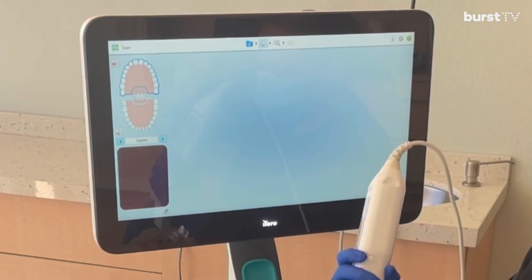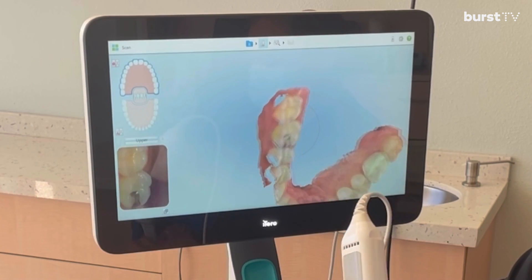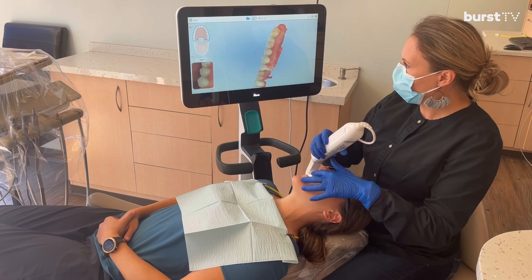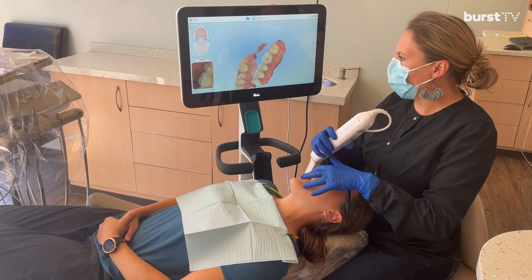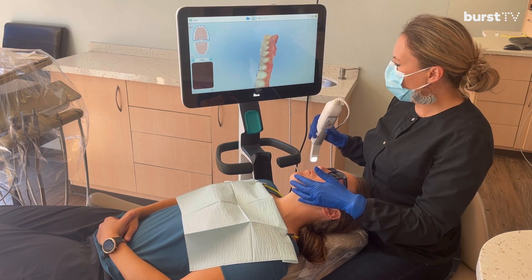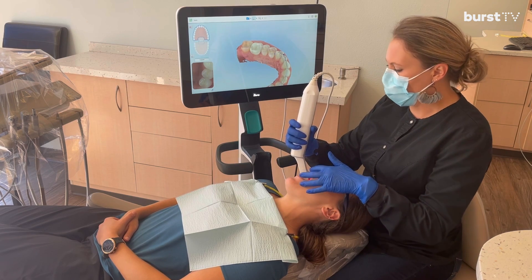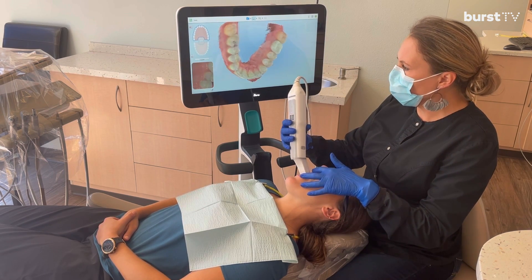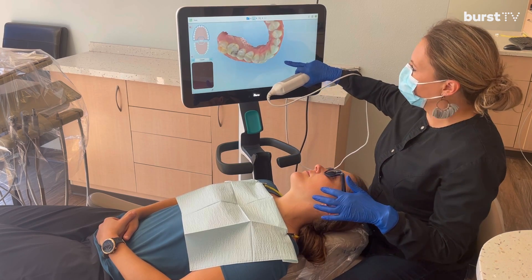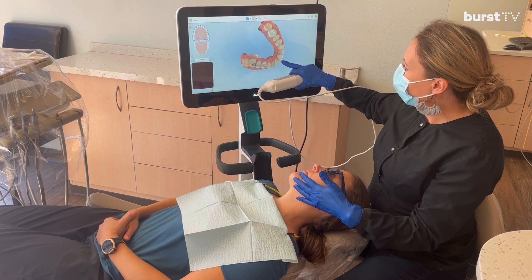And then we go to the top. I am tilting the scanner kind of back right and left as needed. And if anything is bubbly, I would have my patient swallow — please go ahead and swallow. It looks like I got everything except a bit of the incisal edges there, so I'll go right back to where I stopped. Ideally, you do not turn the wand off until you're done with the whole arch. But if you do, it will know exactly where you're at. The best approach is to start back on an occlusal surface, as that's the one it recognizes best.